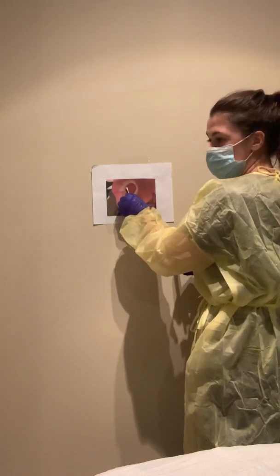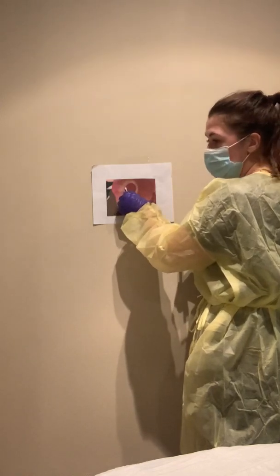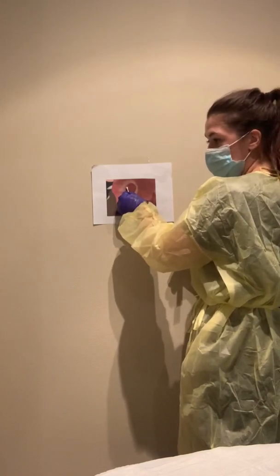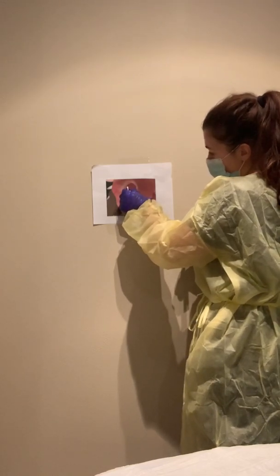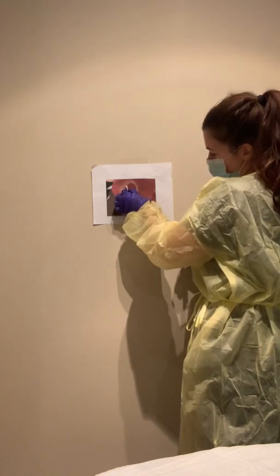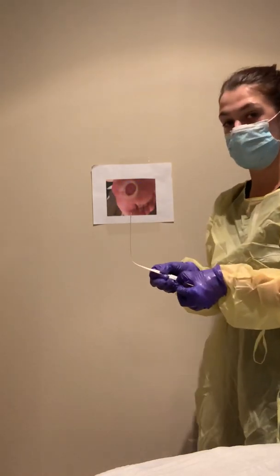So it's really important that as we measure tunneling, we're not trying to cause additional trauma with the probing of our cotton tip applicator. So when we get resistance, we stop. I go ahead and align my thumb again with where that tunneling comes back, and I have access to where that skin first begins to separate, and I would measure my tunneling here.